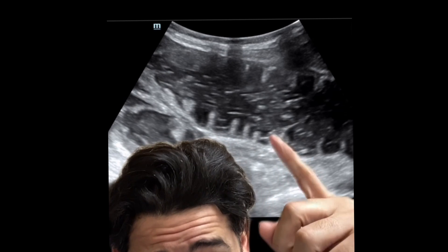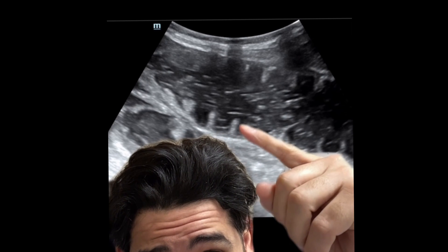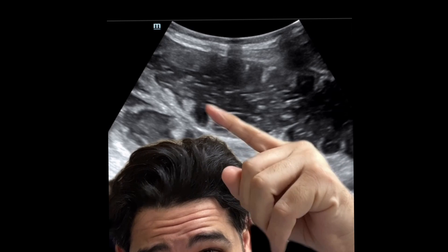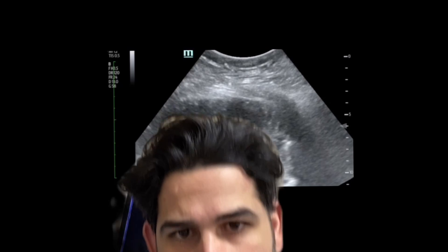Another thing to consider, and this is usually seen in the presence of small bowel obstruction, is you'll have a dilated small bowel with these little tooth-like projections. That's plicae circularis. Here's another example. These are more prominent in the duodenum and jejunum.